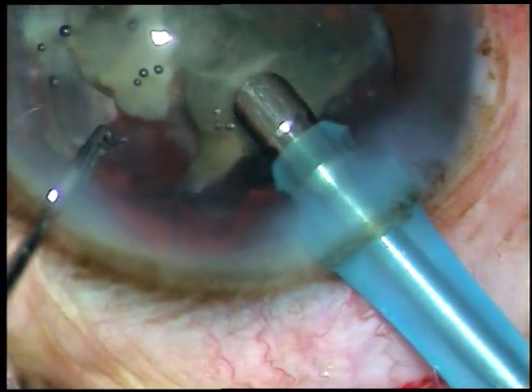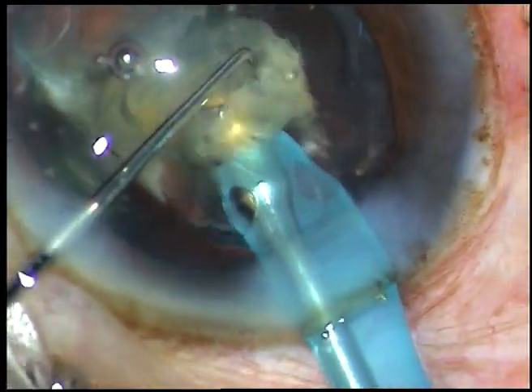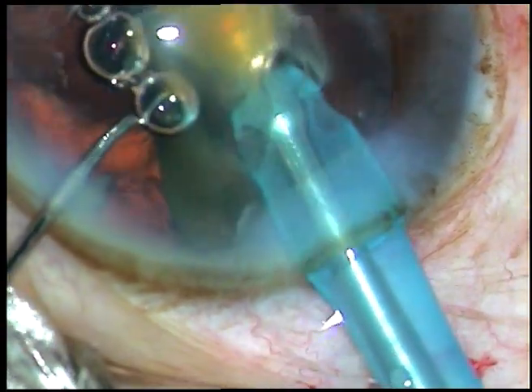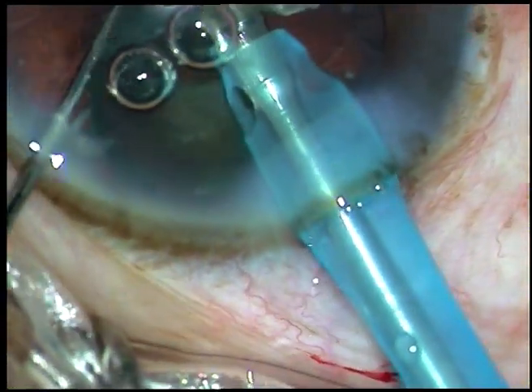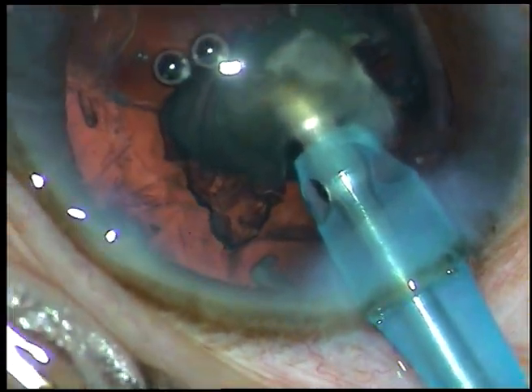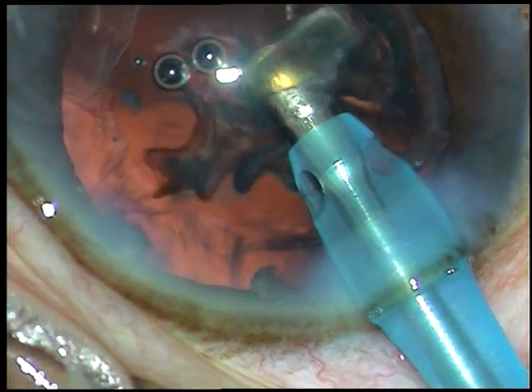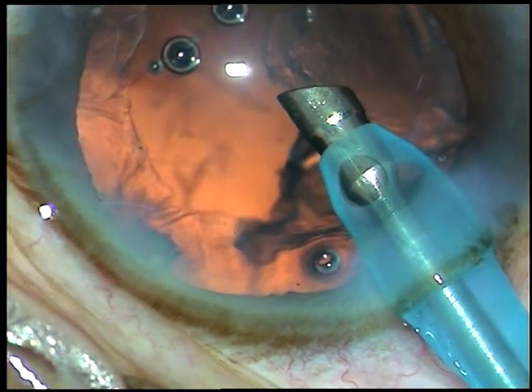The CTR has been applied and now I go again with the tip of the phaco handpiece. At this time, I could see that the fragments are moving very freely and I could emulsify the pieces comfortably. The posterior capsule is far back and this is the last fragment. Very slowly and keeping an eye on the posterior capsule, I could manage the nucleus.